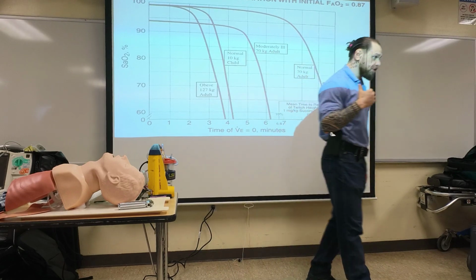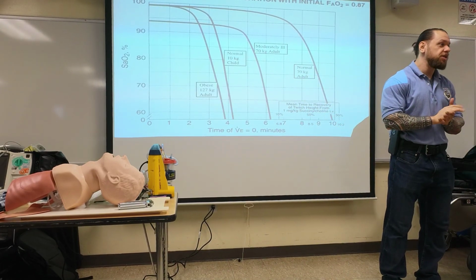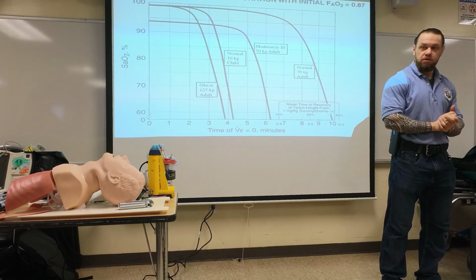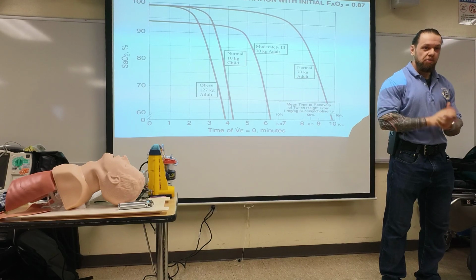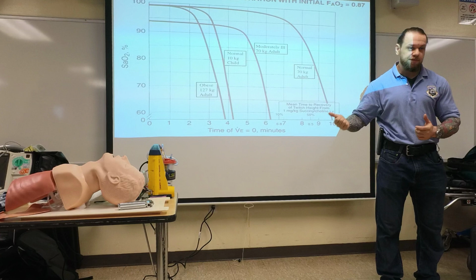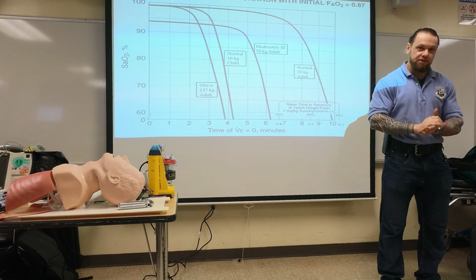But what they don't tell you on this graph is the people doing this procedure are trained anesthesiologists whose technique is flawless. Why is the technique flawless? They do it too much. They're by themselves. And if they fail, they push all these drugs and they cannot ventilate. What happens to the patient? They're dead. And what happens to the doctor?